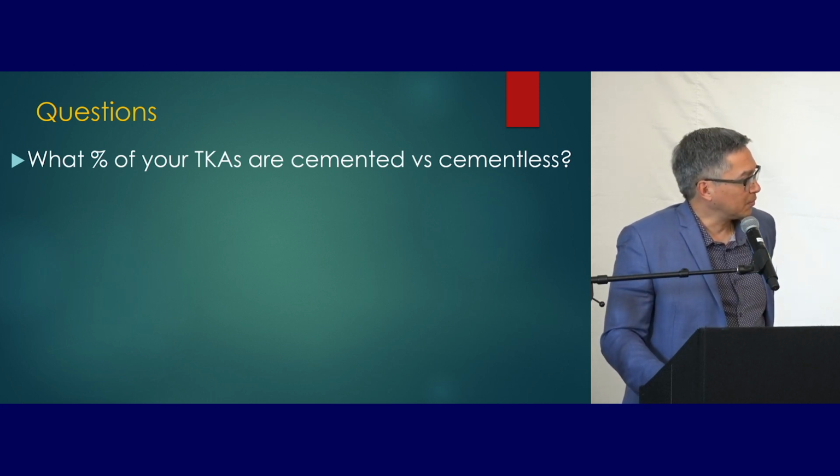Jay, did you ever do any cementless total knees, or were you all cemented? All cemented, and I'll wait for data to justify its additional cost before embracing it. And Keith, it sounds like you have some indications for cementless fixation, basically gender and age primarily. Correct. So probably about 30% of my practice right now is cementless total knees, and I gauge the age ranges and gender, and just subjective bone quality intraoperatively.